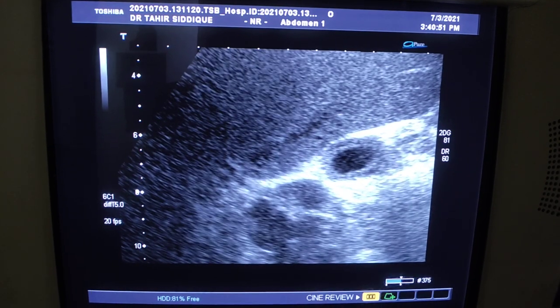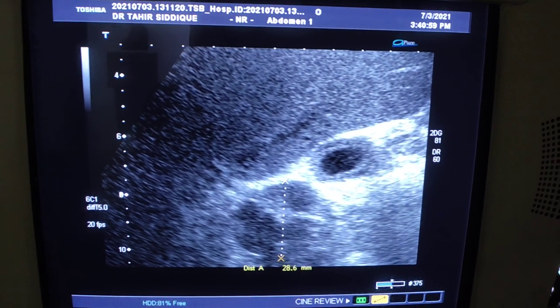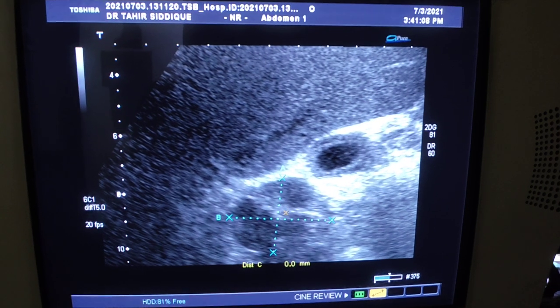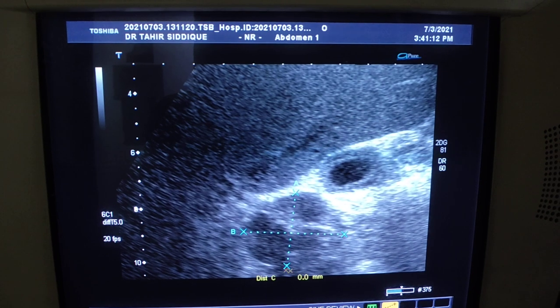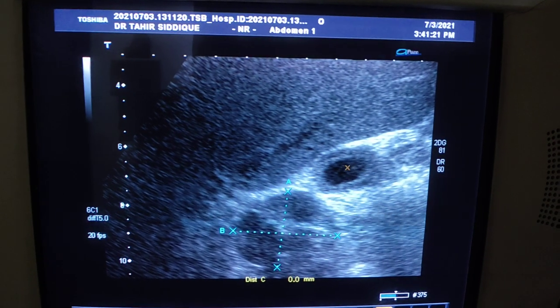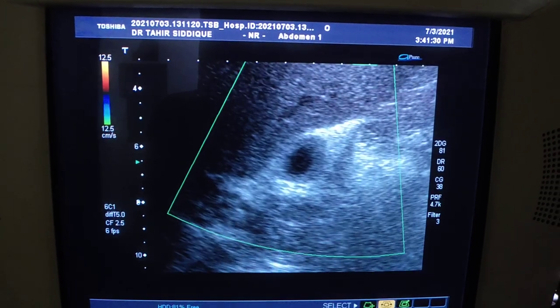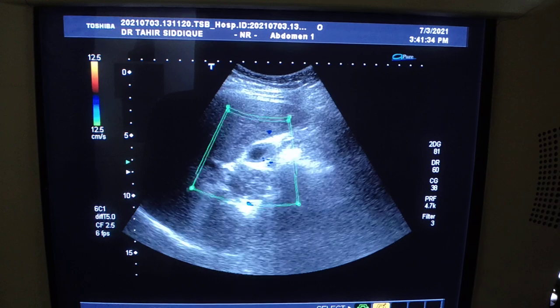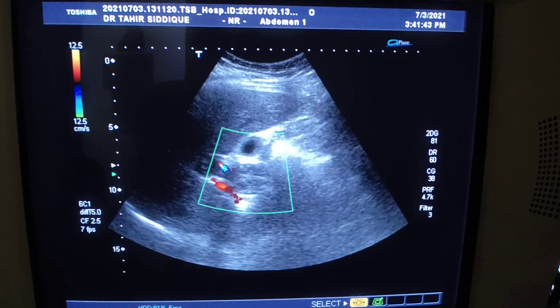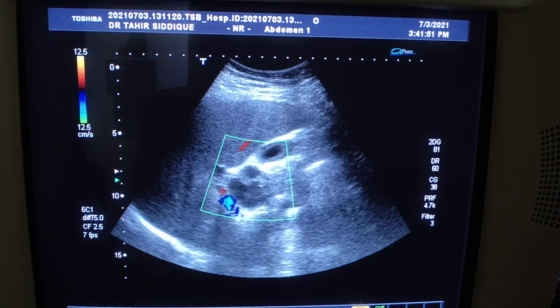This is the common bile duct, and this is a solid mass — almost cystic, with internal echogenic areas and septa, and no posterior wall enhancement at all. It is well-demarcated. This is the gallbladder and the liver. This pathology is relating to the common bile duct and is the cause of the dilated CBD. It does not take blood — no blood flow is seen within it.